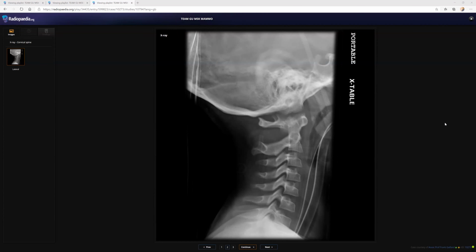I cannot see anything else in this. If you are stuck, you can tell me that you would like to skip the film and see the next film. Okay, I would like to skip that. Like that, you can save time. Okay, you want to skip this? Yes, I would like to skip that. Okay.